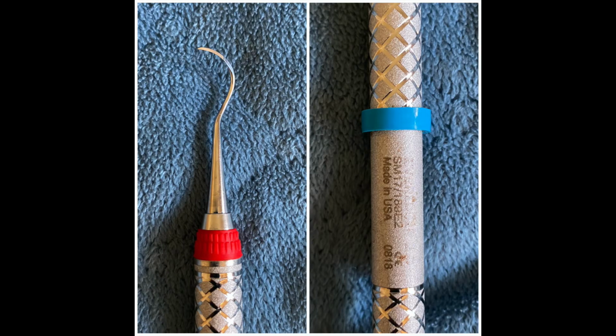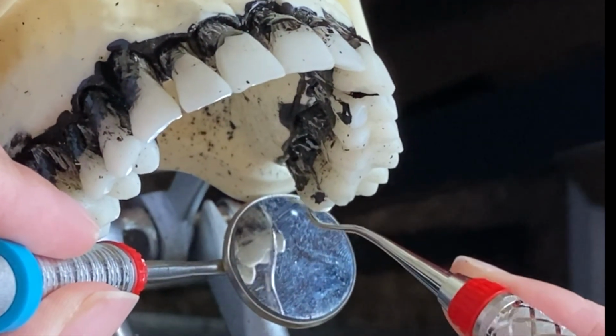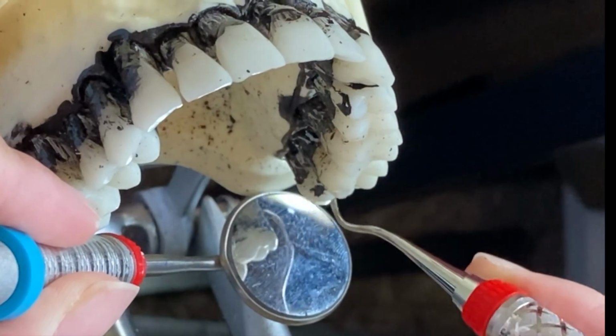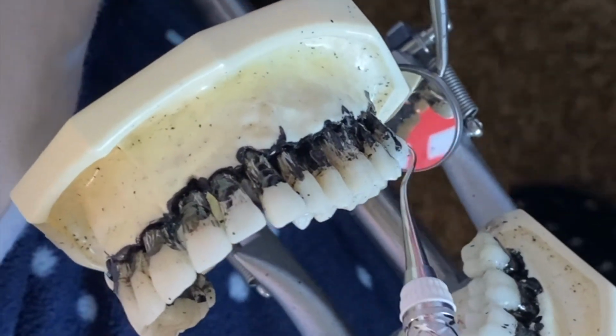The next instrument I'm going to use is the McCall 17/18, and this instrument is beneficial on the distals of second and third molars. This can be used with vertical strokes, starting at that distal surface, going from lingual to facial. Then I like to go from facial to lingual.